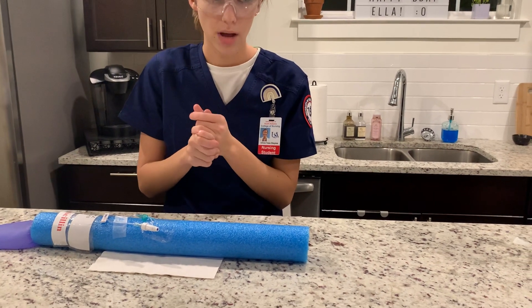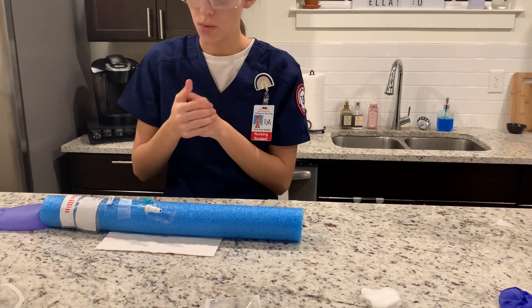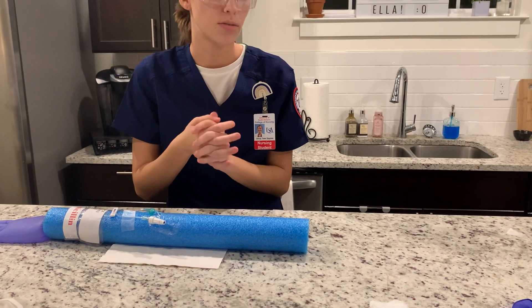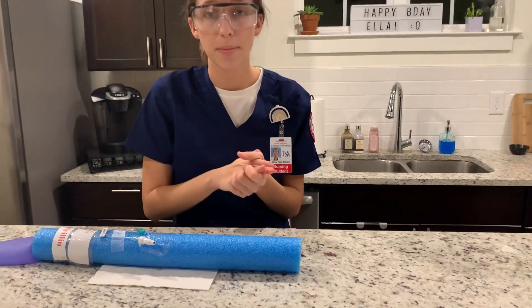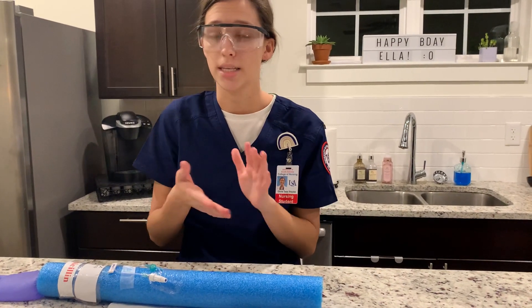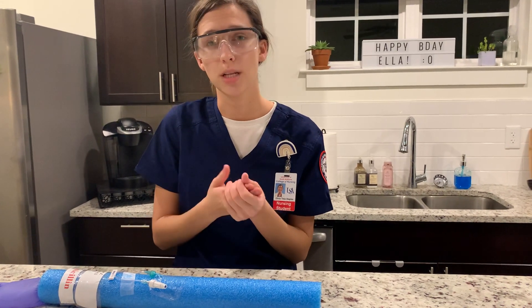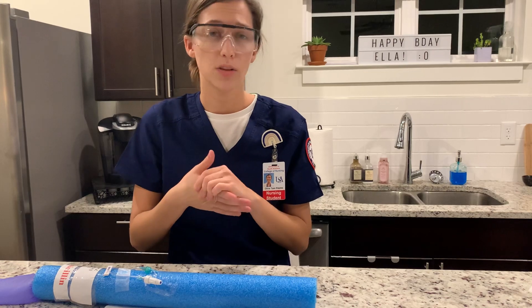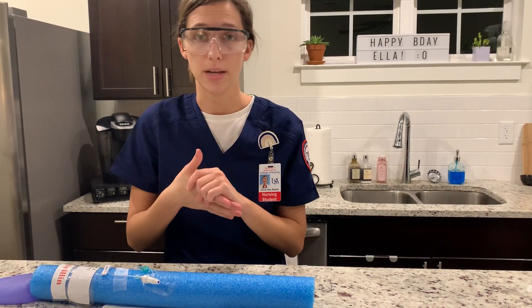Now I'm going to perform hand hygiene and document. I'm going to document the date, time, location, number of attempts, catheter size, gauge, how the patient tolerated the procedure, whether a saline lock was used or flow rate, and the method of infusion.